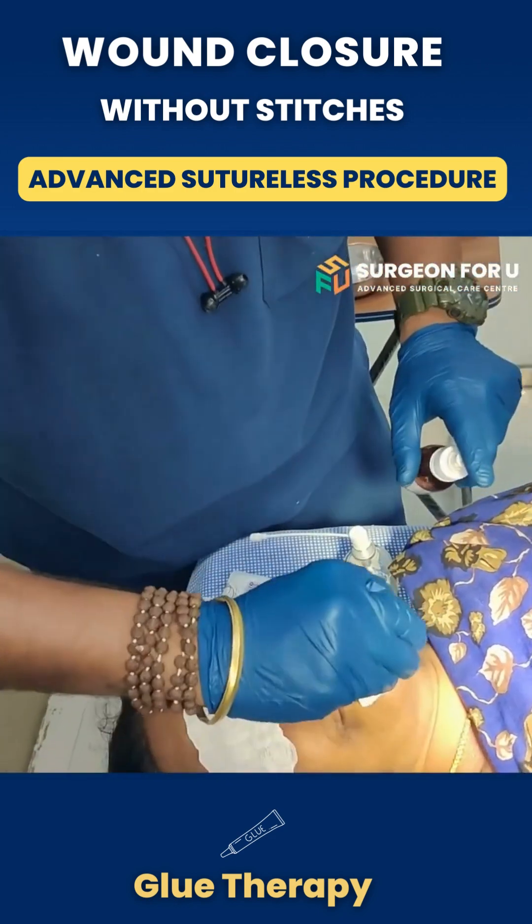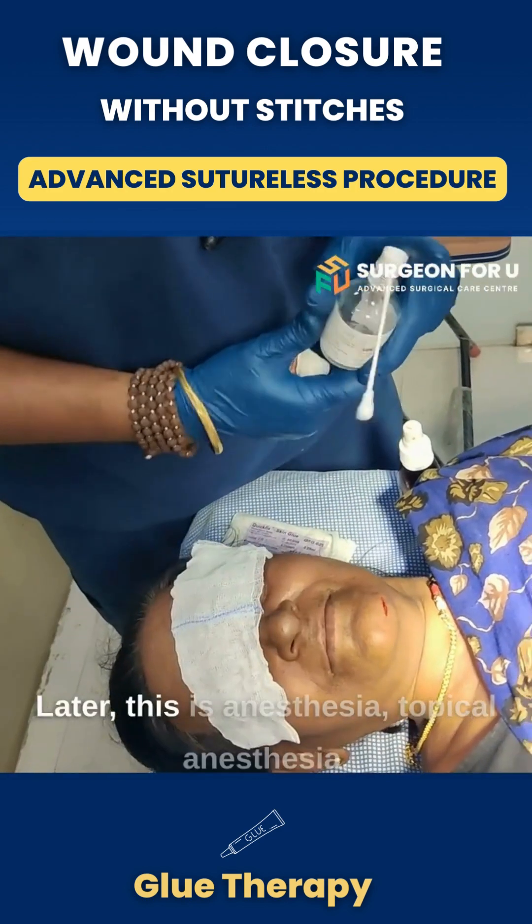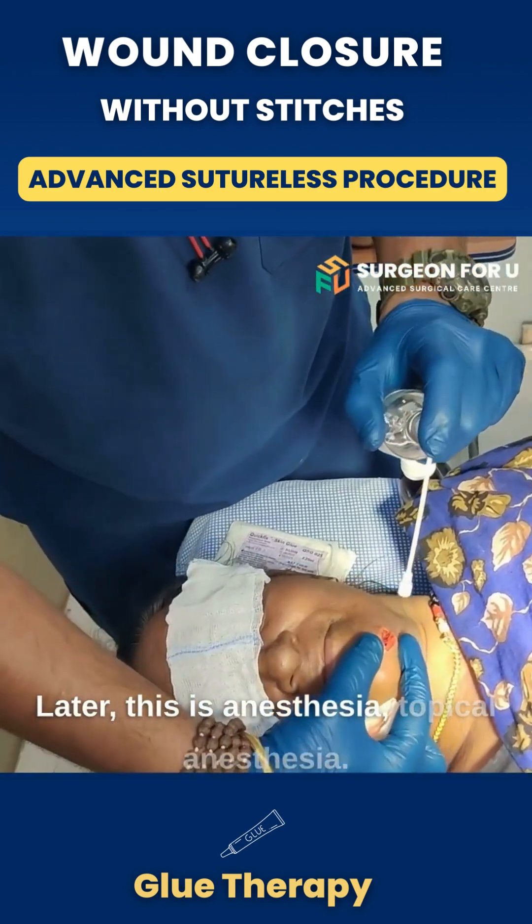Cleaning. This is how we clean. Later, pre-anesthesia — topical anesthesia.